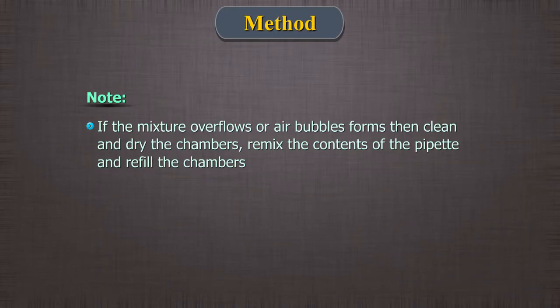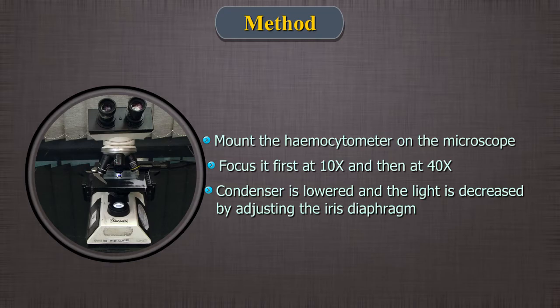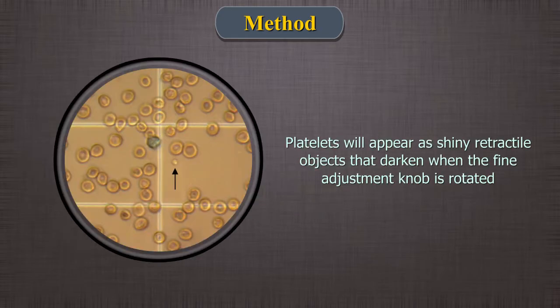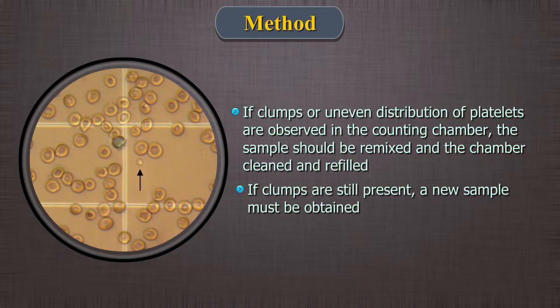Note: if the mixture overflows into the moat or air bubbles occur, clean and dry the chambers, remix the contents of the pipette, and refill both the chambers. 5. Mount the hemocytometer on the microscope and focus it first at 10x and then at 40x. 6. The platelets are seen more easily if the condenser is lowered and the light decreased by adjusting the iris diaphragm. The platelets will appear as shiny retractile objects that darken when the fine adjustment knob is rotated. If clumps or uneven distribution of platelets are observed in the counting chamber, the sample should be remixed and the chamber cleaned and refilled. If clumps are still present, a new sample must be obtained.